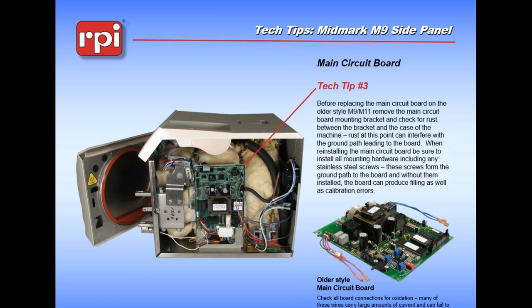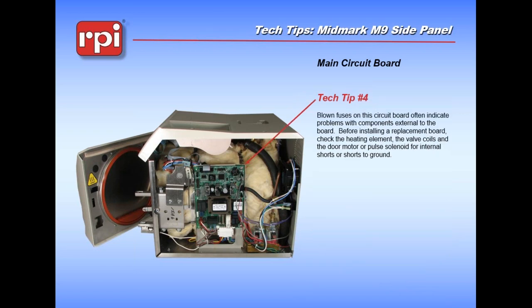These boards are refurbished by our company. If you are going to be sending them in for credit, we give you credit for the original board. You will be sending the newer style board with its mounting bracket as you see it here. For the older style board, we ask you to keep the mounting bracket and just send us the board.